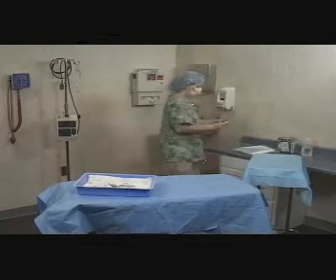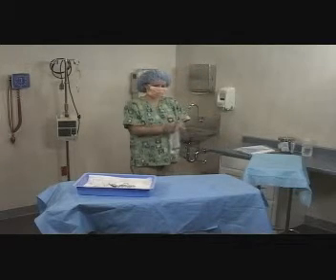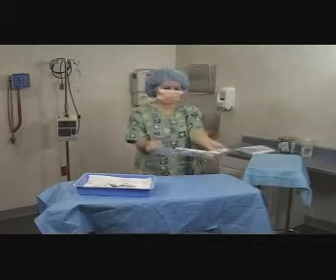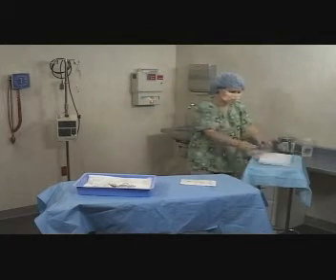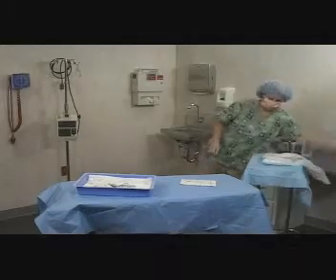This is done when a sterile gown is also required during surgery, for example. The nurse opens the sterile glove package and carefully drops the inner package on a sterile surface. She then opens the gown packaging and places the inner package on a clean surface. She performs surgical hand washing, then approaches the gown.